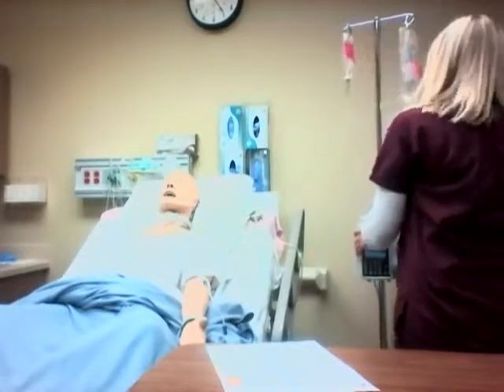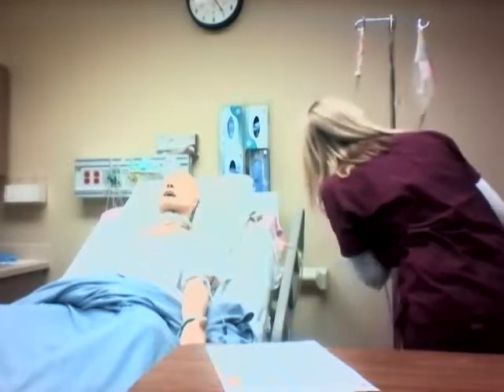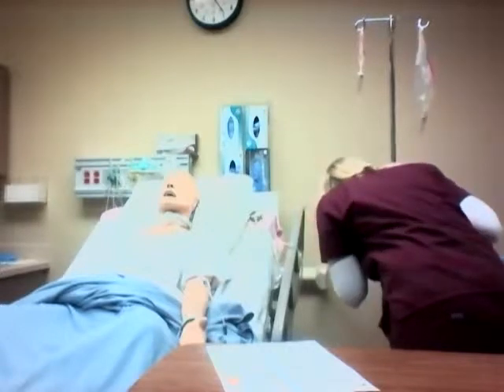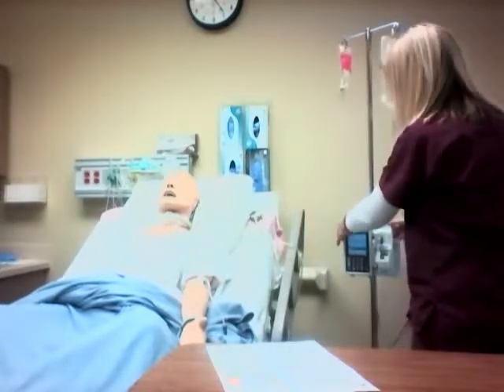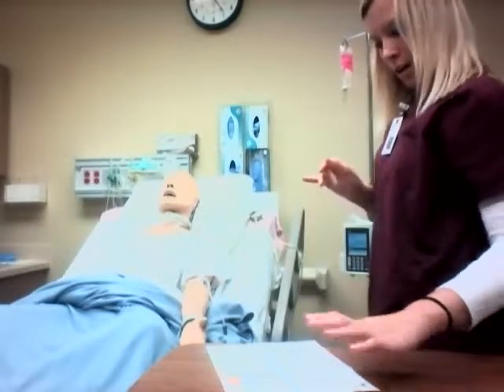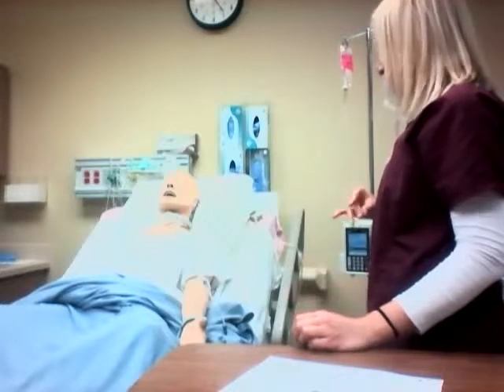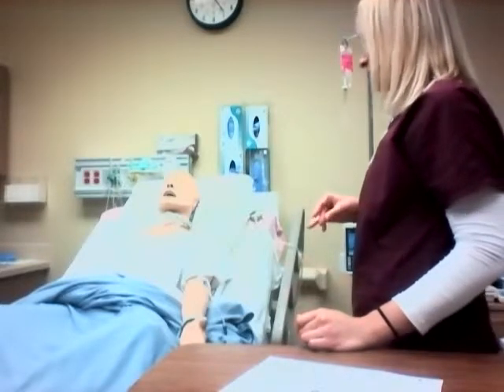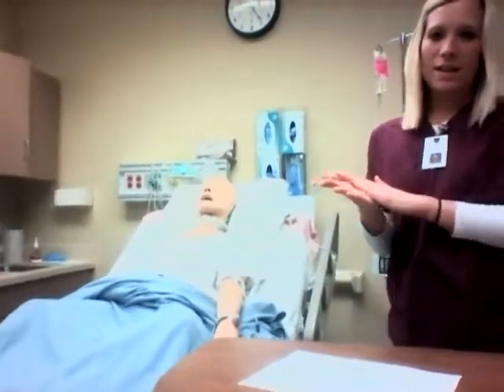And then I'm also going to go ahead and lock the pump. And make sure that my line B is open to infusion. Okay, so I've got that locked. Okay, Mrs. Smith, if there's anything else that you need or you start feeling any of those symptoms, please use your call light and we'll come in to assist you. I'm going to wash my hands and exit the room.